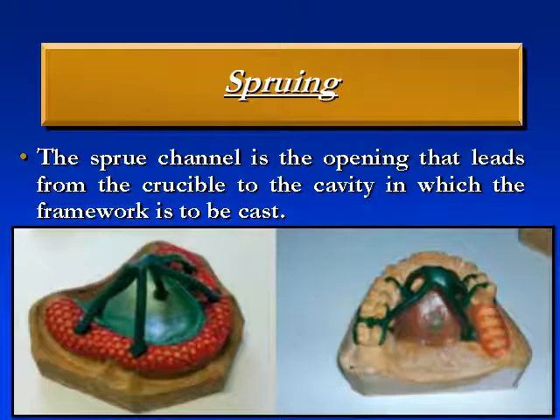Now, after completing the waxing of the metal framework, we start with sprueing.